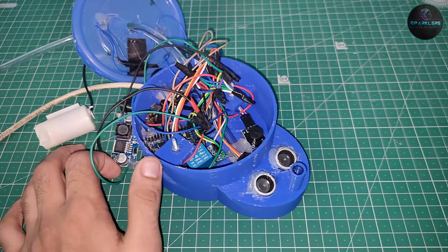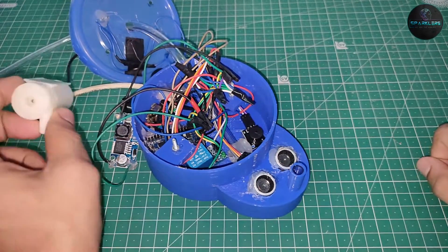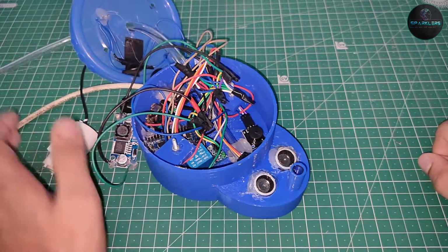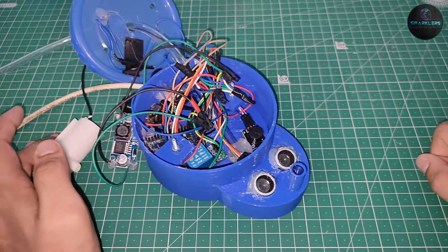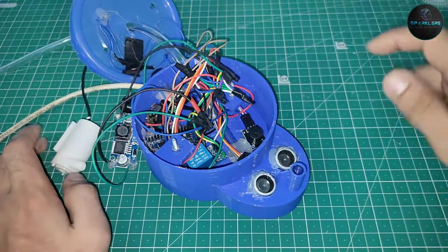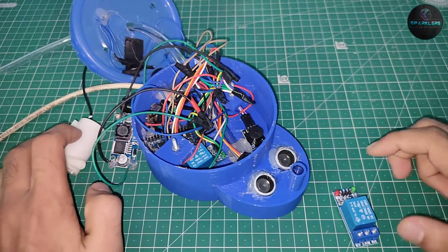Now then we have the pump. In the case of the pump, there are two wires. One is the red wire, one is the black wire. The red one is 5 volts and the black wire is ground. Now like I said, you cannot power this pump directly from Arduino because it requires more current, so you need a relay to power this up.